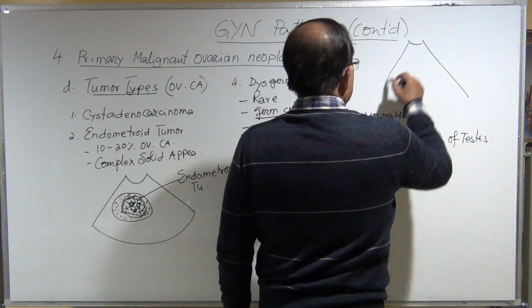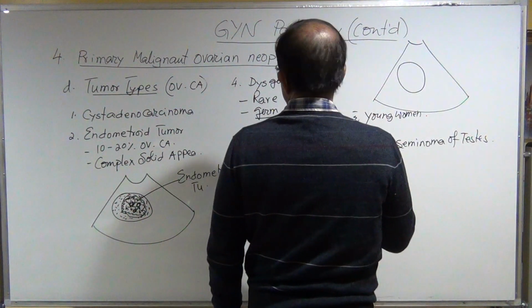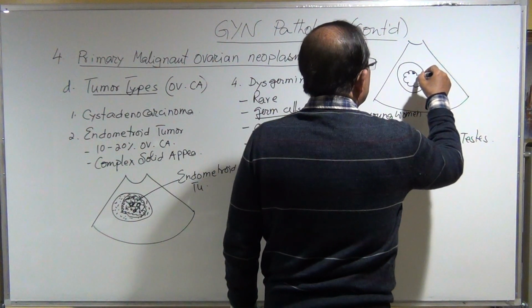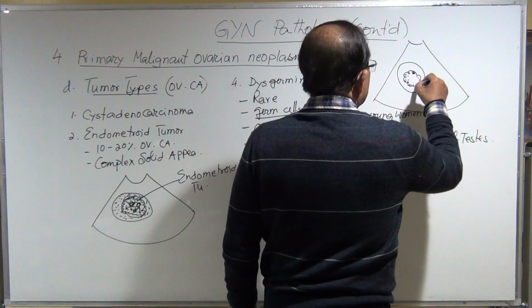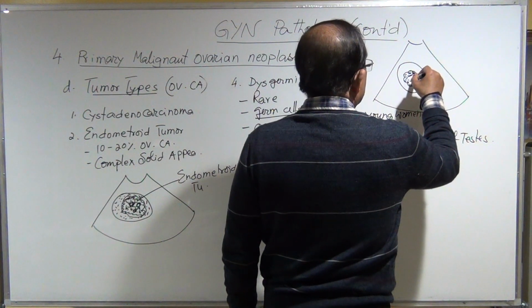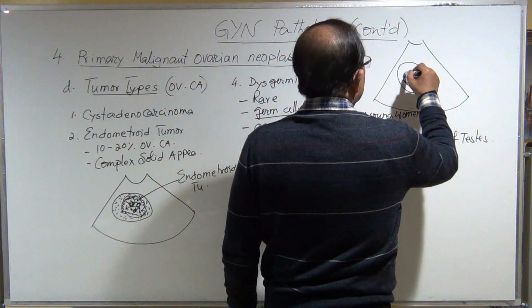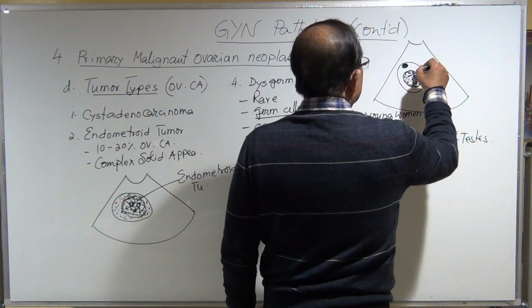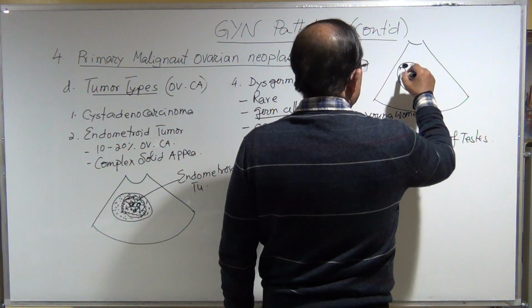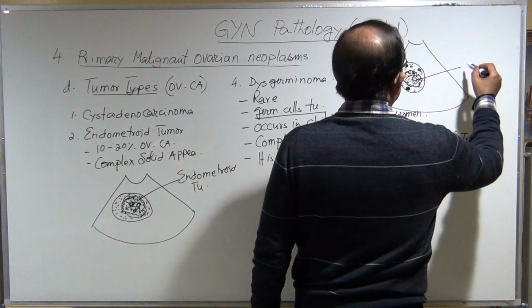If this is an ovary, and okay, so this is dysgerminoma.